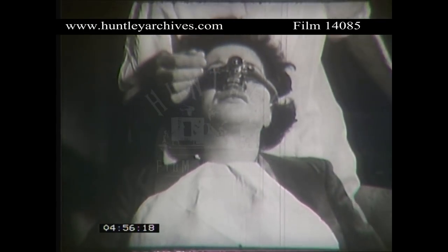It must be so placed that it will prevent the twisting and slipping movement which results from crossing one leg over the other. The strap must maintain the pelvis against the back of the chair. In those cases where the patient will not tolerate a dental prop, a Mason's gag is inserted in the early stages of induction. Open the mouth with your finger and thumb in the sulcus, or by the dental surgeon depressing the mandible with the ball of the thumb, whilst you support the forehead.